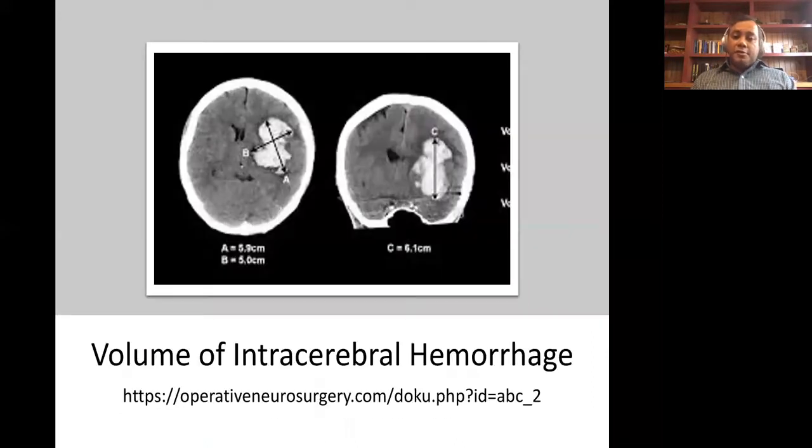You can also assess prognosis, as I mentioned, for diagnosis and then prognosis. You can look at the size of the bleed and measure that bleed. The most commonly used formula is ABC by 2, based on Kothari's initial work, and measure the length in centimeters. So take it in 3 planes, and once you get the volume, that would be in ml. If you have a volume more than 60 ml, that is considered not so good a prognosis. If the bleed extends into the intraventricular space along with that volume, you have some reservations about the patient's prognosis.